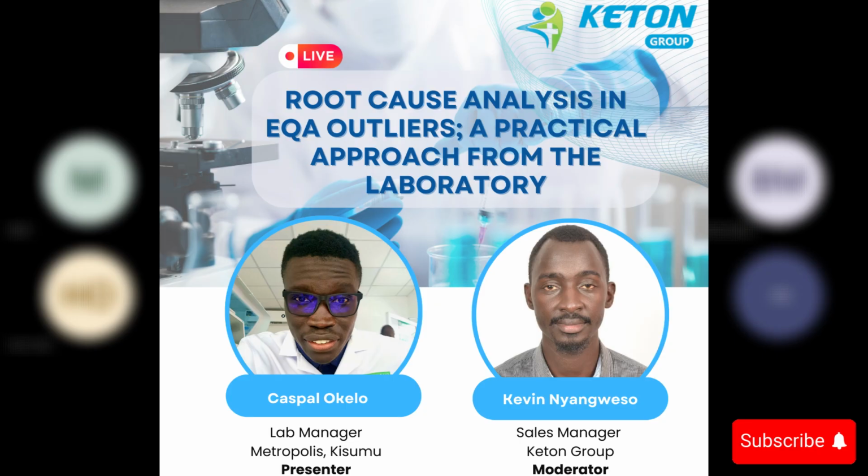So if you have an EQA failure with an apparent bias in hematology, you'll move your IQC review beyond the within-range thinking. So you'll first need to confirm, is it truly biased? Before your deep investigation, you'll ask questions like, is the deviation in the same direction across multiple parameters, HB, MCV, things like that? Is this deviation consistent across levels? Is it both high and low or high and normal?